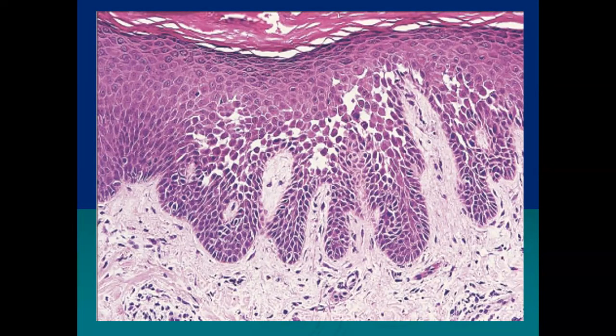This image is a feature of a very typical skin condition, which is Hailey-Hailey disease. So in Hailey-Hailey disease, there is acantholysis, that is breakage of desmosomal junctions, but the acantholysis is not diffuse or uniform, it is irregular, which is also known as partial acantholysis, and this appearance is known as the dilapidated brick wall appearance.